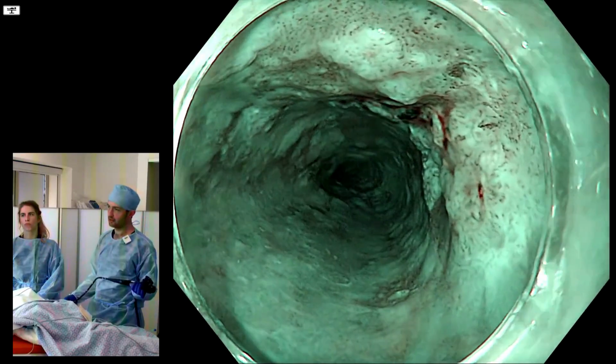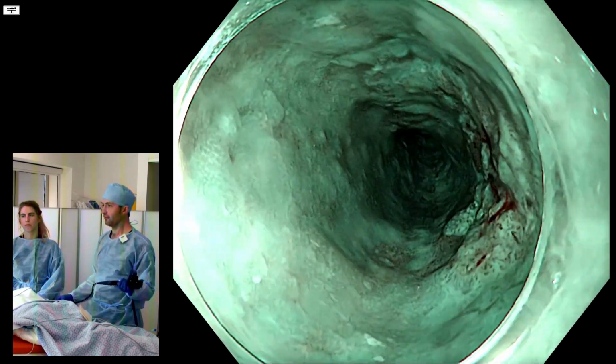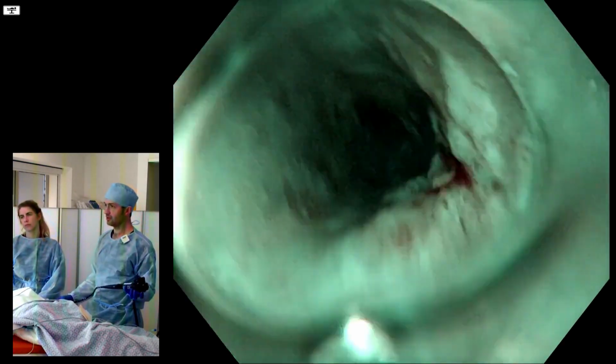And then the most important thing is some great pictures, right? So this is not a great picture. It's in the distance, it's far away, and you might say, well, you've got a patient with anesthetic and you've got the best scope in the world, and all those things are probably true. However, we can strive for better, even if excellence is not possible in the context in which you find yourself.